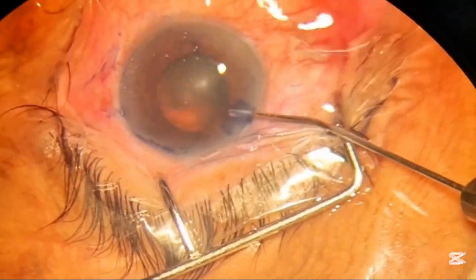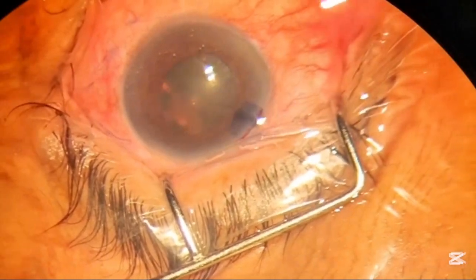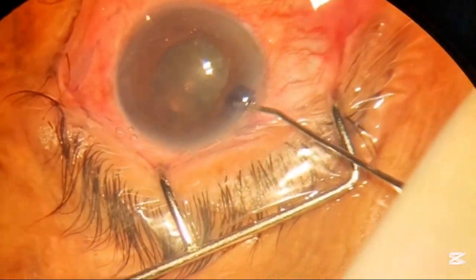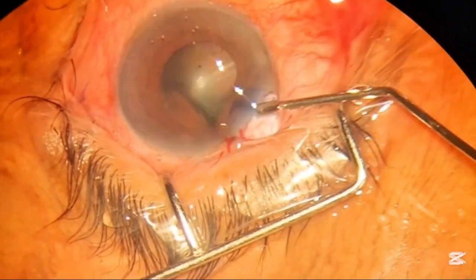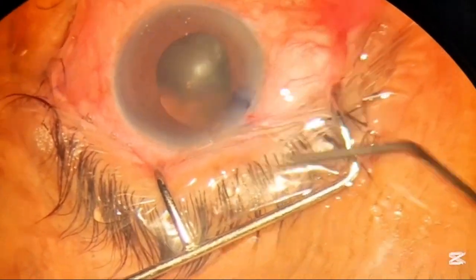Now we are removing the dye after the staining with the help of normal saline and entering the gel into the anterior chamber. Before that we will dilate with some xylocaine adrenalin.